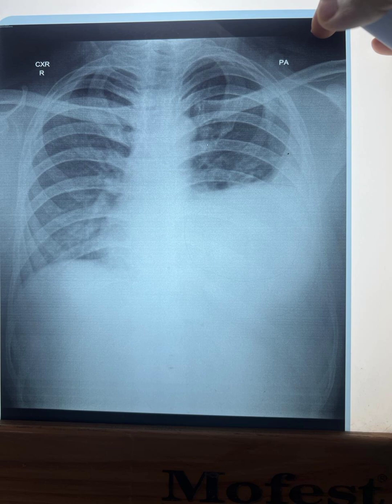And their relation to the mediastinum, practically there is no relation. The lung volume relatively remains unchanged, so the other structures seem not disturbed on the chest X-ray, and the margins are usually ill-defined if it remains within the one lobe. So once it reaches the level of different sulci, you will see a sharp demarcation. Otherwise, there will be fluffy shadows.